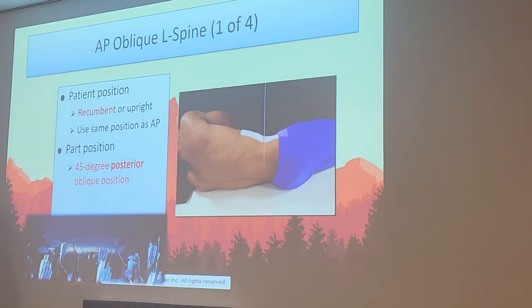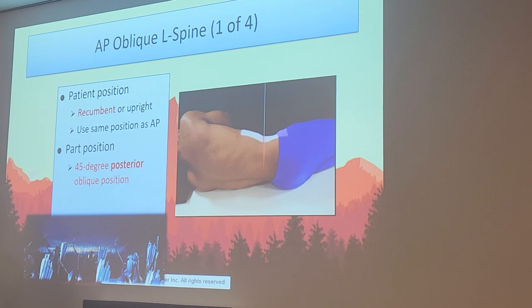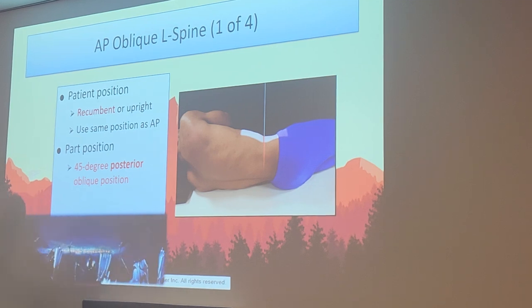So once again, recumbent or upright, you have a choice of either. This is your superior, do it laying down, recumbent. We're going to only do, by the way, LPOs and RPOs. That's what we're learning per the book. Even though there is an option to do anterior obliques, we're only going to do posterior obliques because they're superior and more optimal. Please keep that in mind. We will always do a 45 degree posterior oblique that includes our LPOs and RPOs. It must be 45 degrees.